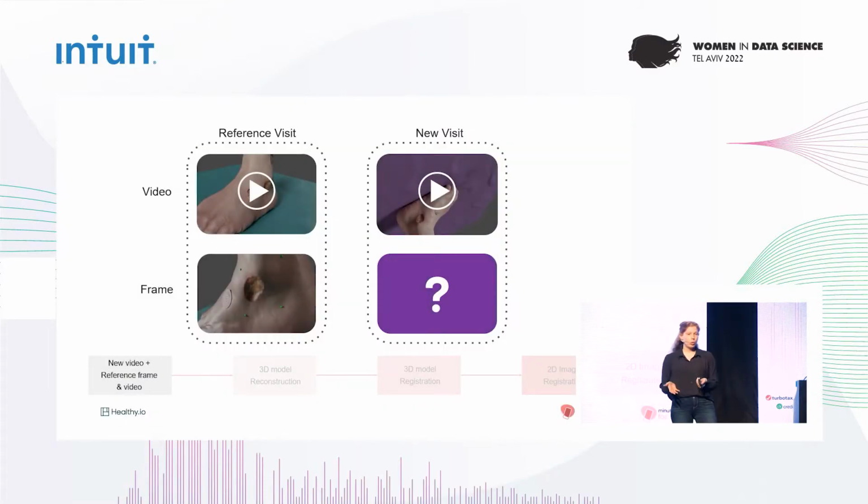Let's begin with the input to our solution. The input to our pipeline is information about 2 visits. The first one is what we call the reference visit, the first visit for this patient, the first image we want in our timeline. And the second visit, it's the new visit when the patient just comes to the clinic to see the nurse. For both visits, we have a video which the nurse takes using our application, where she takes a video of the wound. And for the reference visit, we also have what we call the reference frame, which is the first frame we want to put in our timeline. Our goal, given all this information, is to find a new frame from the new visit video that we will add to our timeline, that we will be able to align to the reference frame.